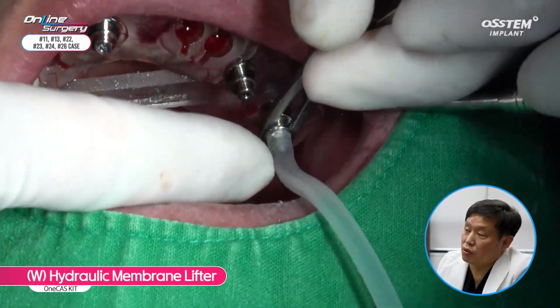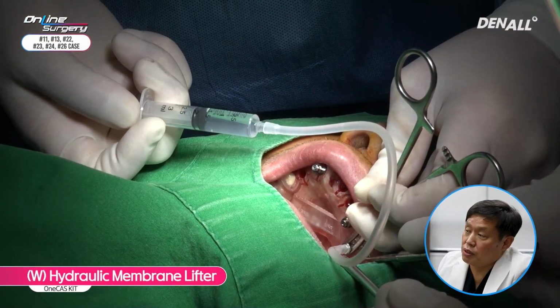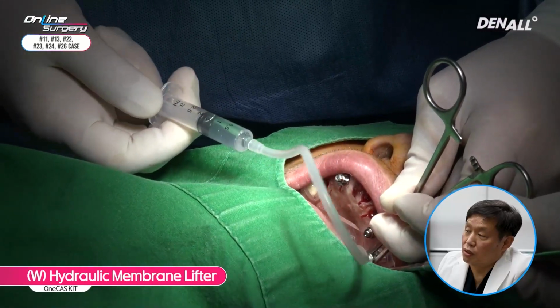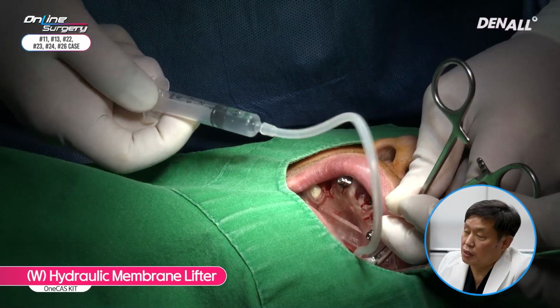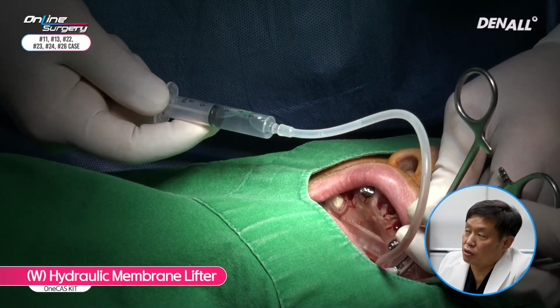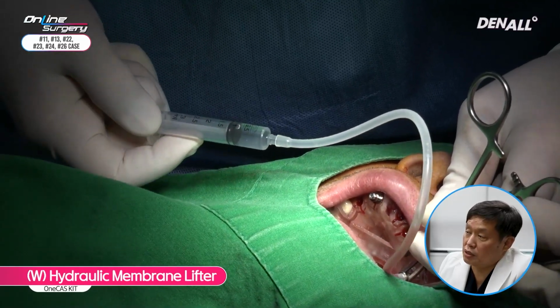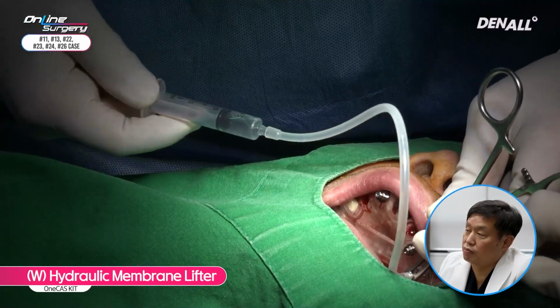This was followed by hydro lift. A 3 milliliter syringe with 2 milliliters of saline. You put in about 0.5 and do regurgitation and then put in some more. Aspiration was done again. Blood did not come out. You can see that there's negative pressure. This means that there was no sinus membrane perforation.